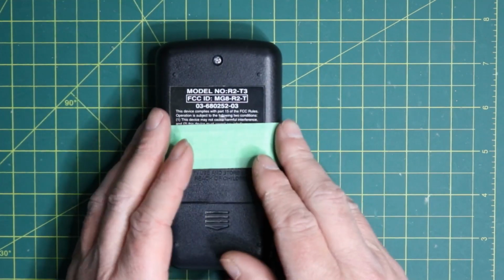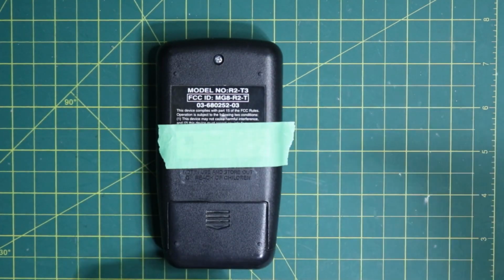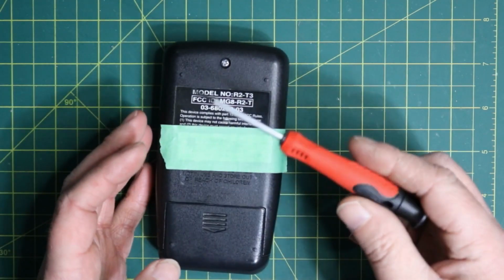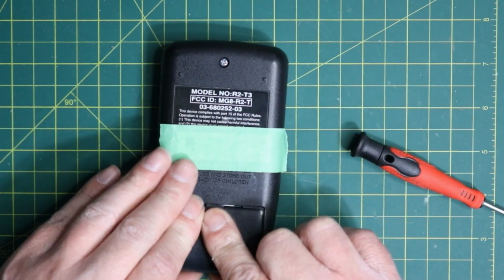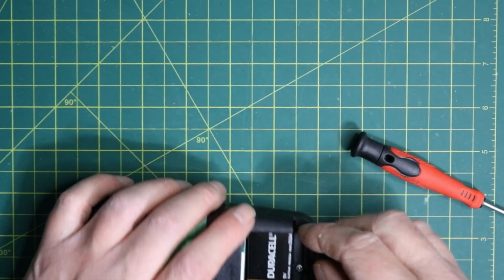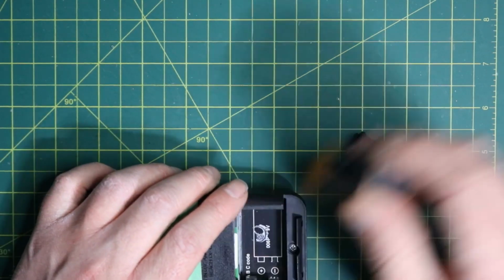So what I'm going to do is I'm just going to open it up in a moment, and we'll get into there. So I do have the tape on the back there just so you can't see the person's name, because you know, old people like to put their names on everything that they own. So let's go ahead, let's pop that battery cover off, and we'll go ahead and remove the battery from the controller.